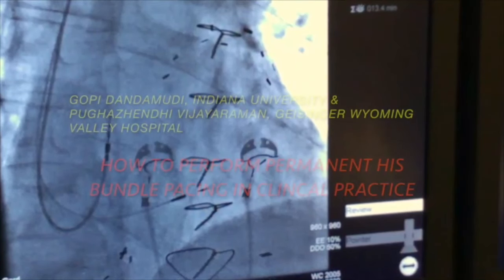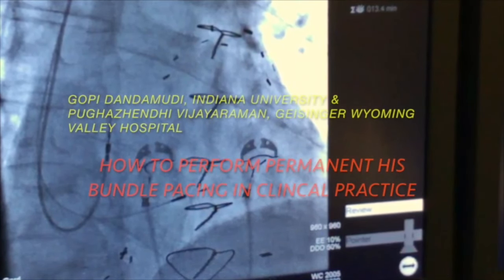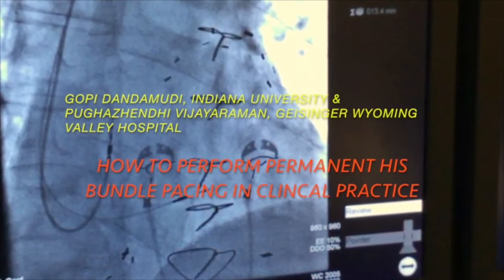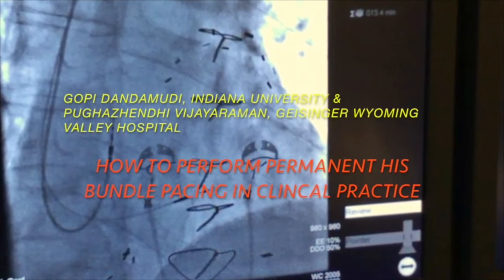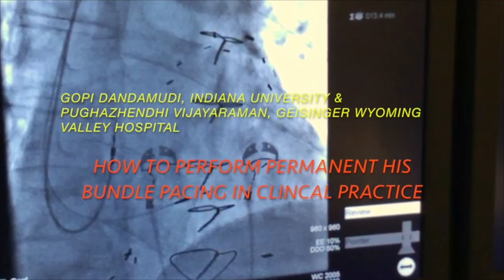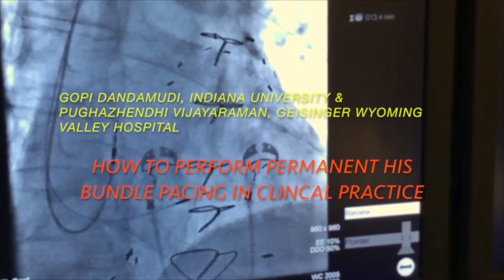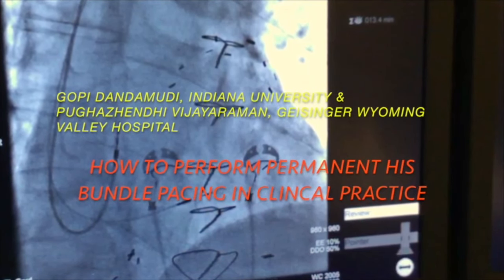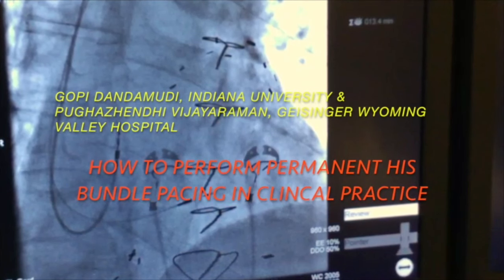In this video, we describe how to perform permanent his-bundle pacing in daily clinical practice. We have been performing his-bundle pacing at our collective institutions for several years. In the past 5 years, we have attempted his-bundle pacing in all patients who have indications for implantation of a permanent pacemaker. Our success rate has been greater than 85% in recruiting the his-bundle.